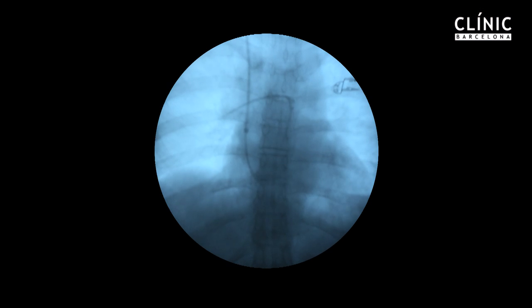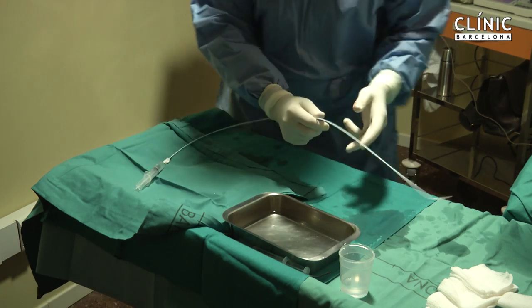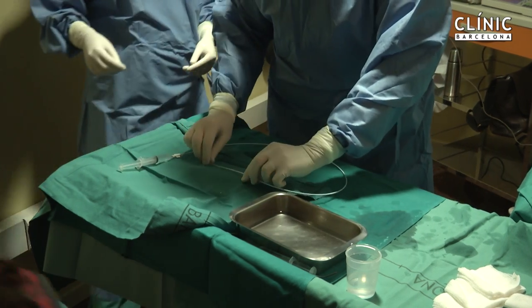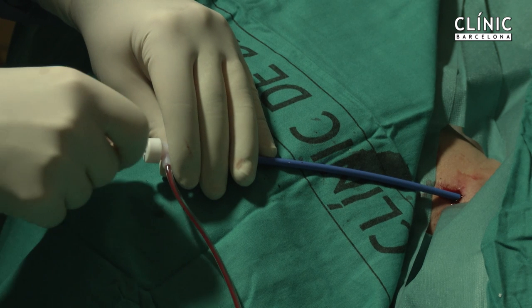Performing a cardiopulmonary catheterization adds only a few minutes to the process and can provide important prognostic information. The right hepatic vein is then catheterized using a multi-purpose catheter.